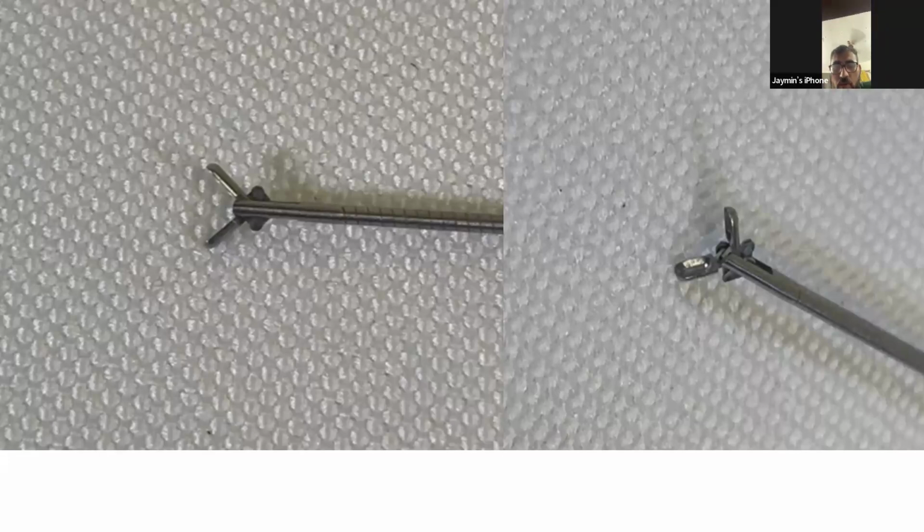Biopsy forceps, sir. Which biopsy? Bladder biopsy. Can't it be used in the urethra? So instead of saying bladder biopsy, say rigid punch biopsy. Rigid. Okay. You don't need to specify that it is used for bladder. Okay. So what is the difference between these two?